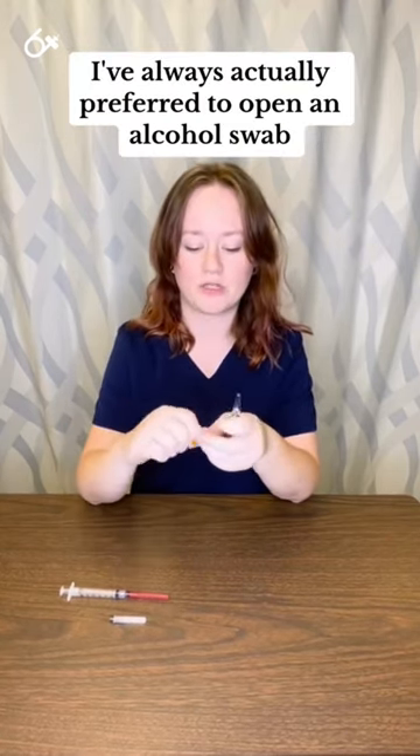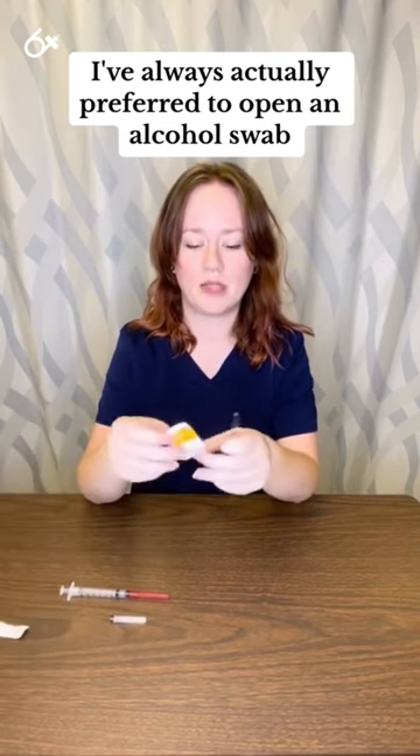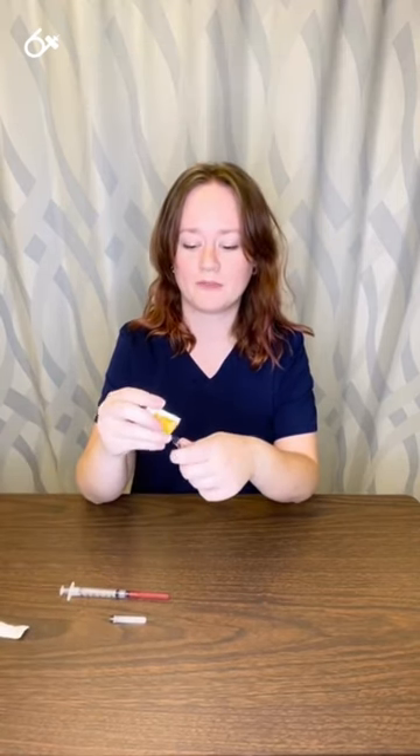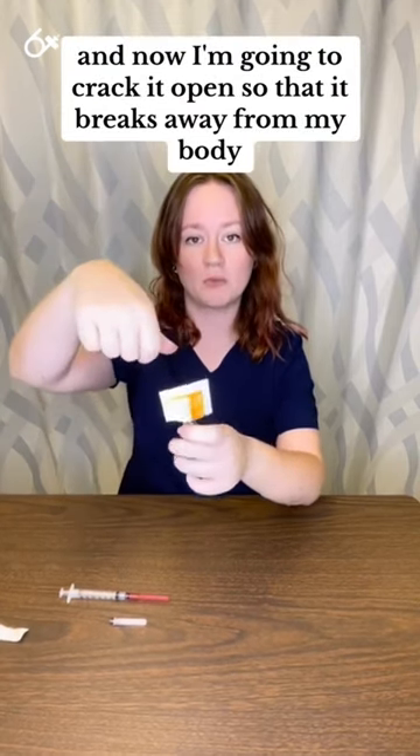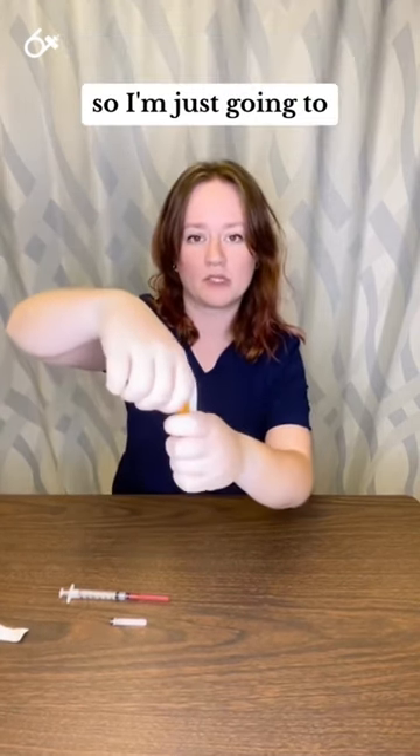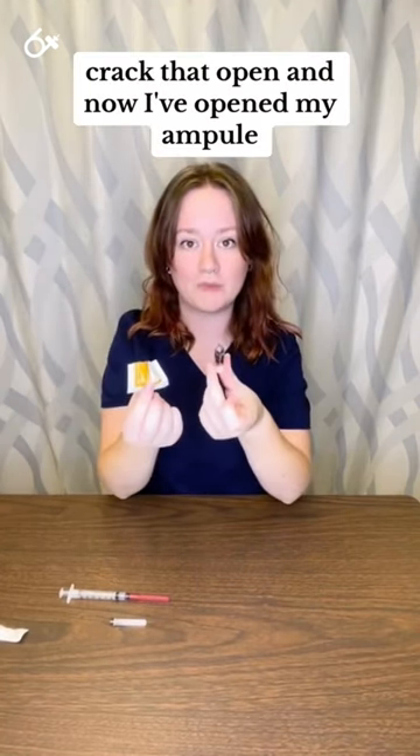I've always actually preferred to open an alcohol swab, insert the head of the ampule into it, and now I'm going to crack it open so that it breaks away from my body. So I'm just going to crack that open, and now I've opened my ampule.